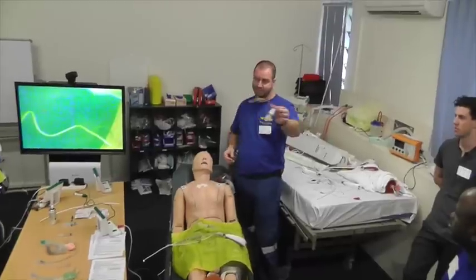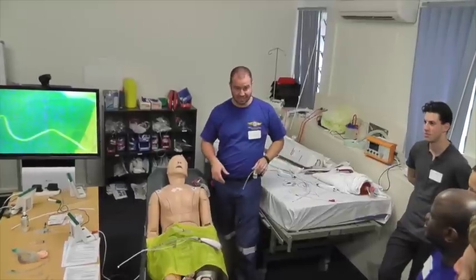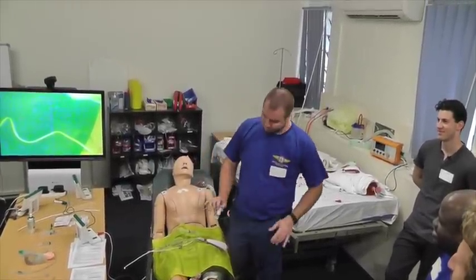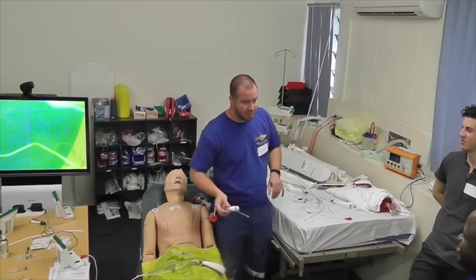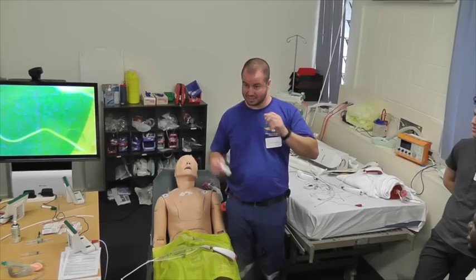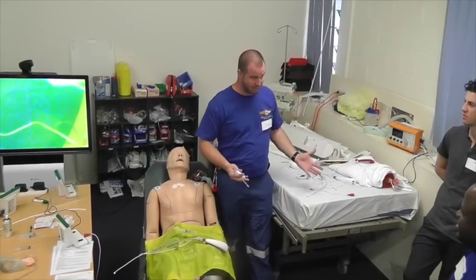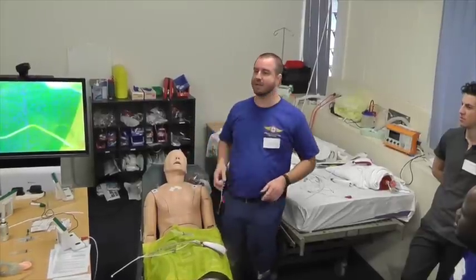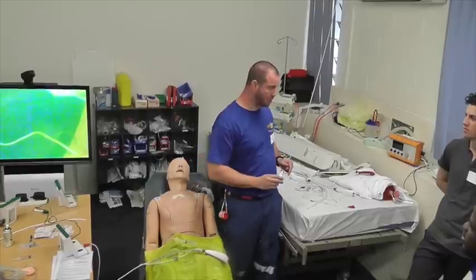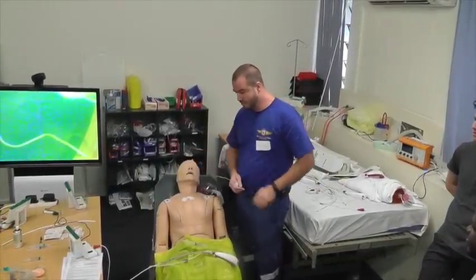This is a local anaesthetic and vasoconstrictor combination. Has anyone had that sprayed at them or on them or in their mouth? How does it taste? Like poo. Okay, it is awful, and you need to warn your patients that it's going to be awful. Because part of the thing about awake fibre optic intubations is the first word is that the patient's awake, and it's about gaining their confidence and keeping their confidence. If you spray this into their mouth without telling them it's going to be horrible, then you're already behind the 8 ball in terms of the rest of the procedure. I'm sorry, this is going to taste awful, it's really horrible.